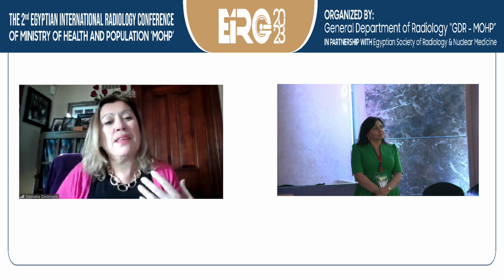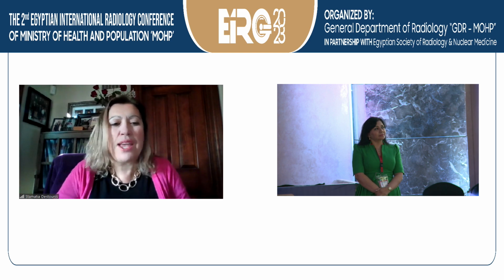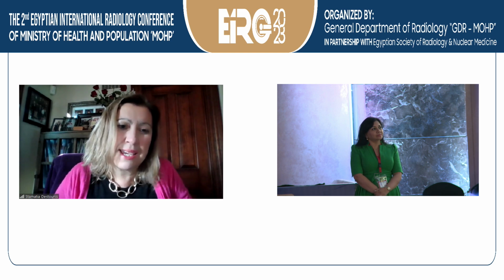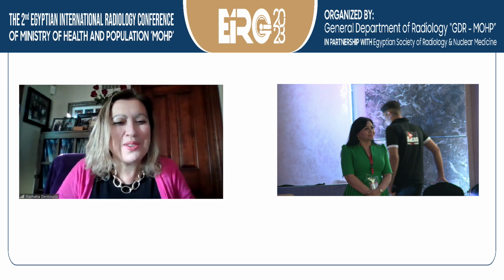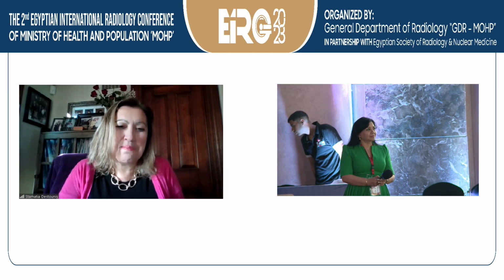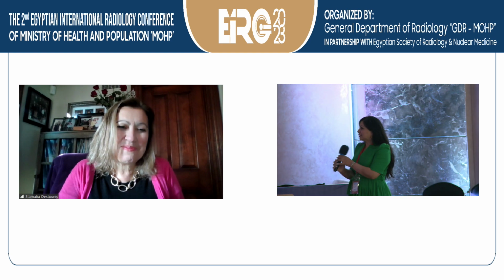Now, if it's something that you've seen before or in both breasts, obviously you can give that a BIRADS 3. But I think focus was in many cases used when we didn't know what to do with something. And we do that with ultrasound also and in the mammogram, and we just wanted people to commit to working something up. Well, okay, thank you for explaining that.